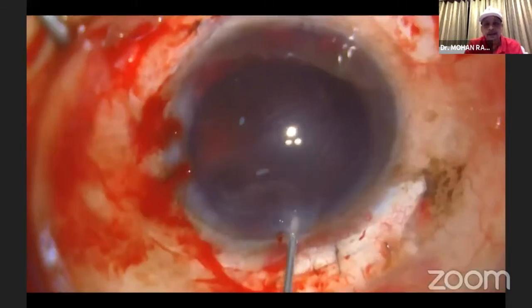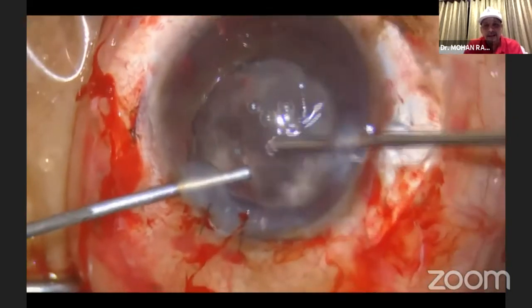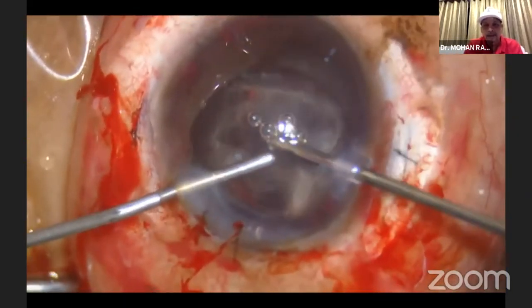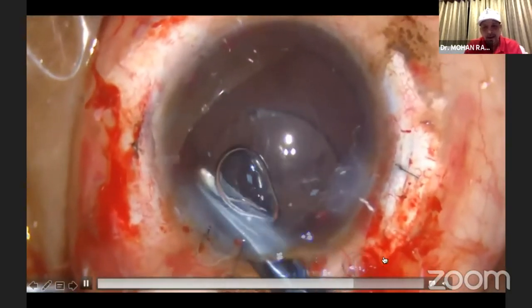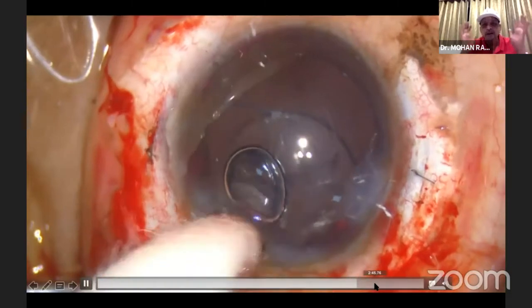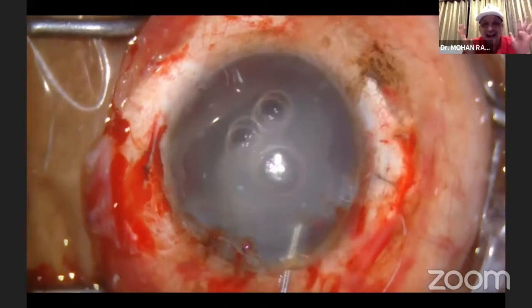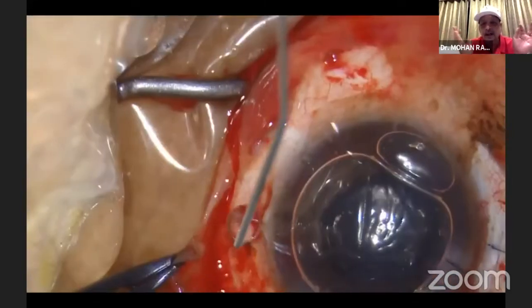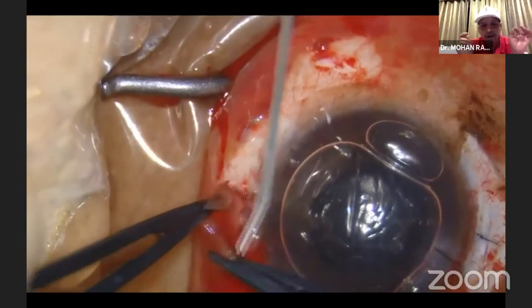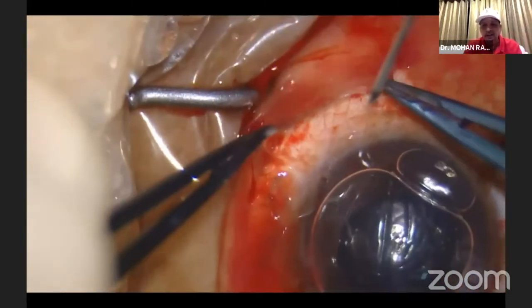And making sure again — checking whether there is vitreous in the anterior chamber, repeatedly putting triamcinolone, preservative-free triamcinolone, and then going ahead. This is what happens when you have the mental block and self-doubt. When you're not operating for a long time, you don't think as well. And that's what happened here. Ultimately, the patient did very well. I put Miocel, there is no vitreous, and glued the conjunctiva.